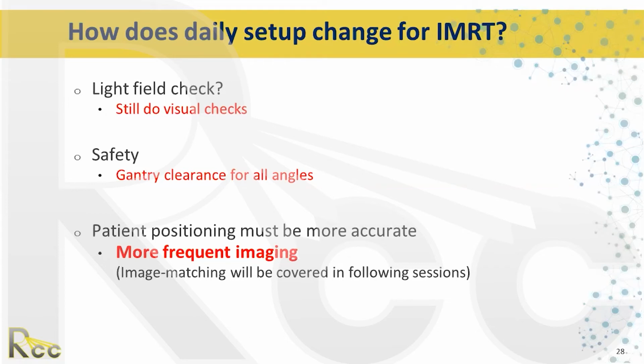You're making sure your patient's set up the way they're supposed to be, confirming with your notes, and then you can also check the pictures that you took on the first day, confirm that the ISO center is placed on the correct part of the body and it matches what you did before. You're checking your gantry clearance, making sure everything clears.